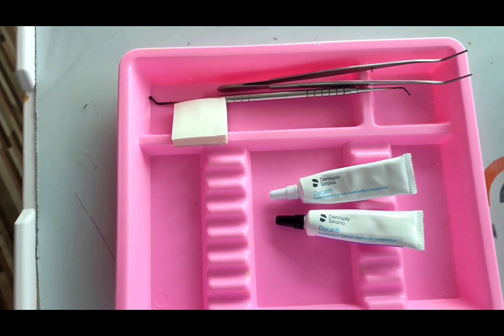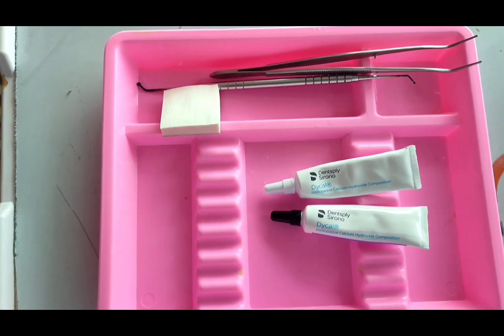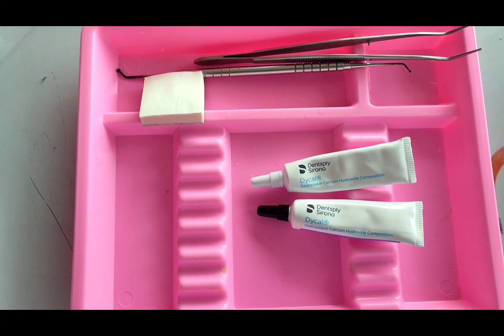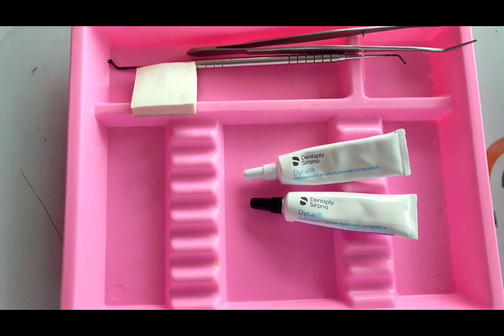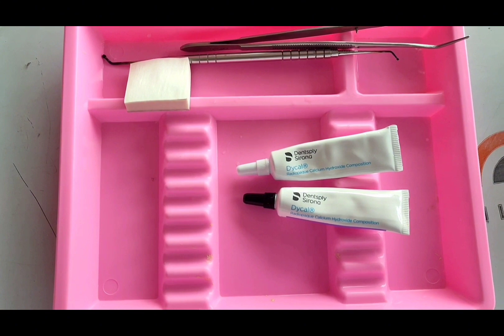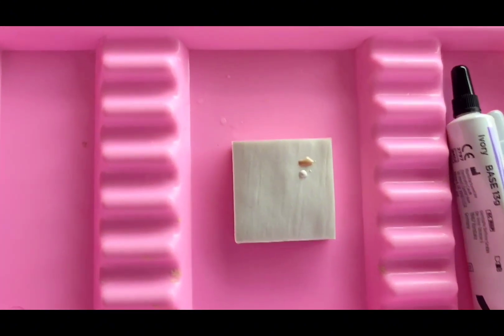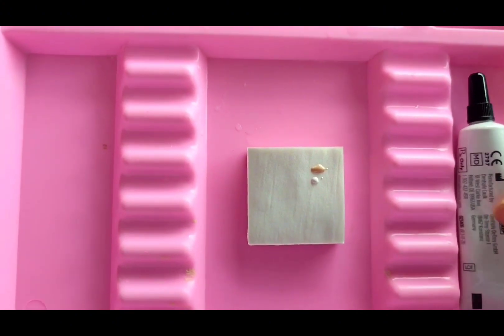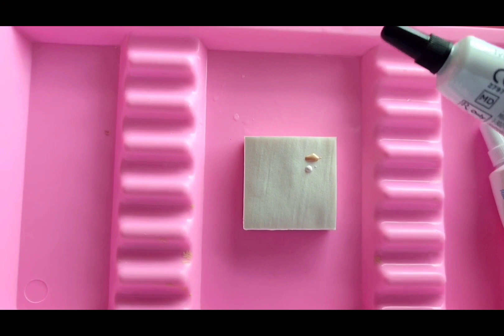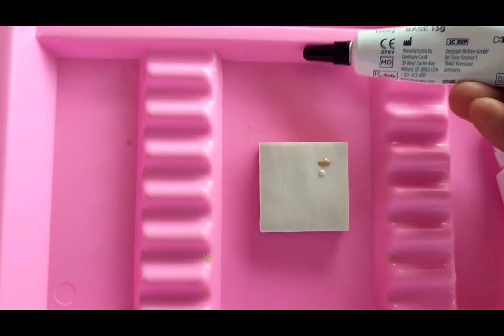For direct pulp capping, under rubber dam isolation, complete the cavity preparation outline using a high-speed bur under constant water cooling. If caries is present, completely excavate using low-speed or hand instrumentation. Gently dry the preparation with a cotton pellet, then dispense equal volumes of base and catalyst paste on the parchment paper pad.